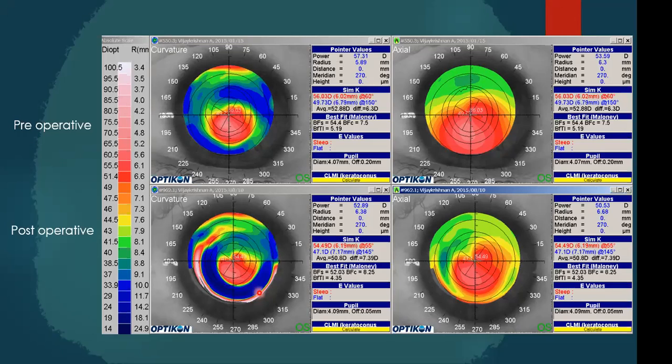So could somebody, Sumit, any of your residents, would they like to unmute themselves and tell me what procedure could have been done? They can unmute or they can type in the chat box also. Even that is fine. Yeah. So please type the answer. I hope you don't need any options for that. To treat a keratoconus, there are hardly 3-4 options available, especially treating the front. Which treatment do you all feel could have been done in this patient?